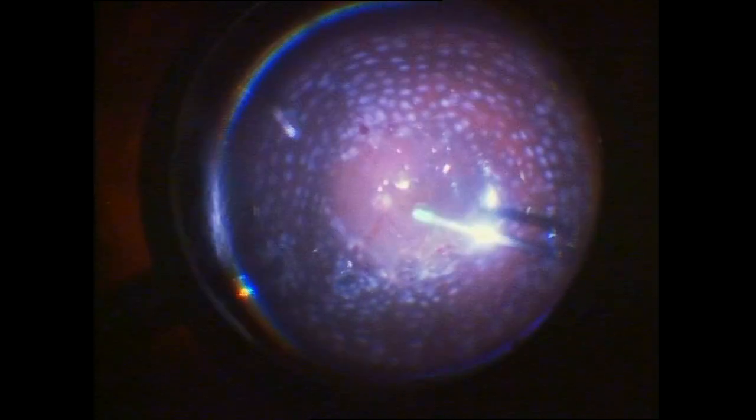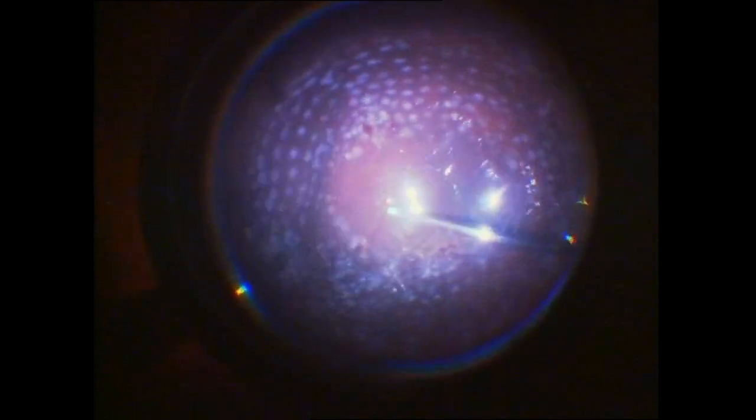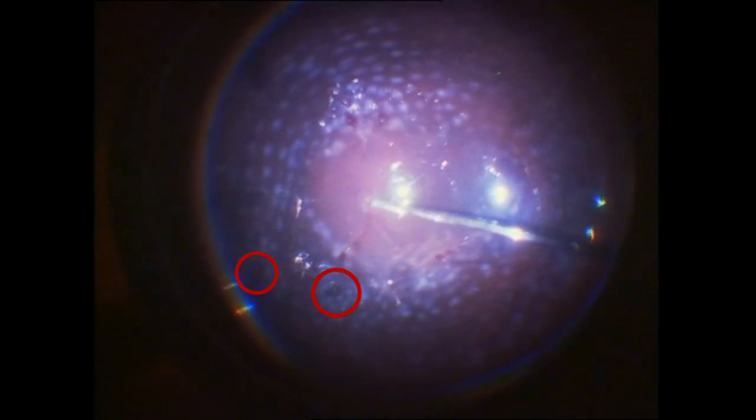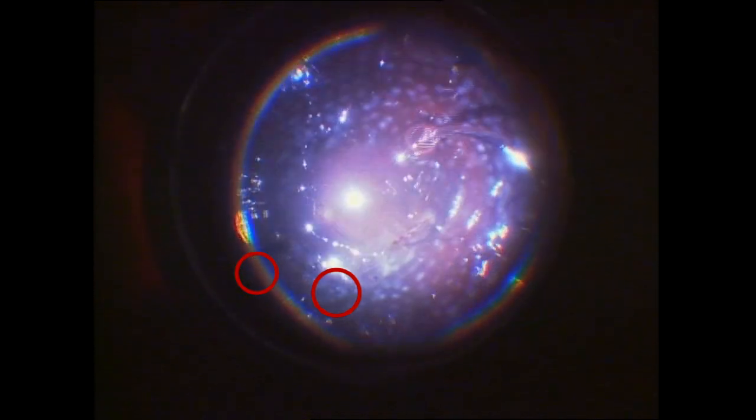In this case, despite the advanced stage and the complex nature of the diabetic detachment, there were just two iatrogenic retinal breaks. Silicon oil tamponade was used.